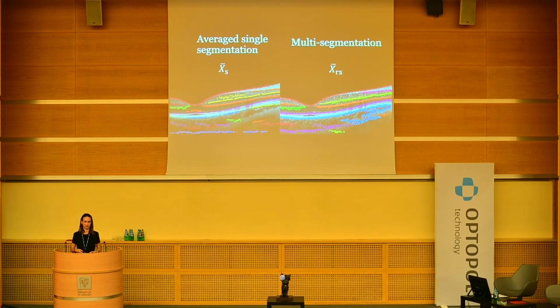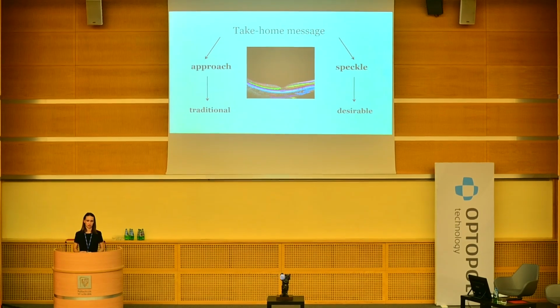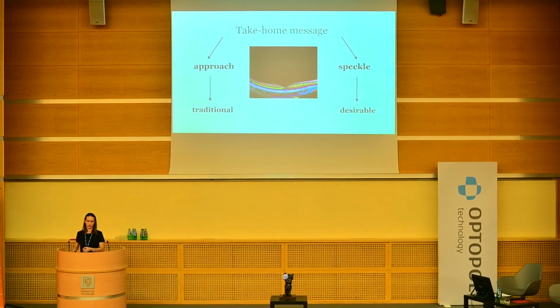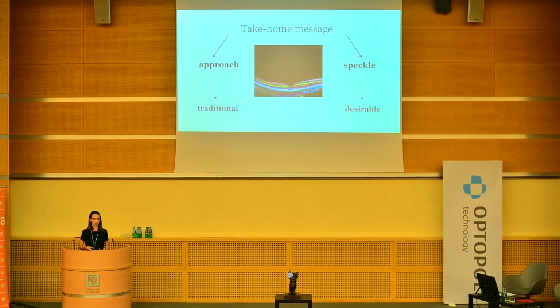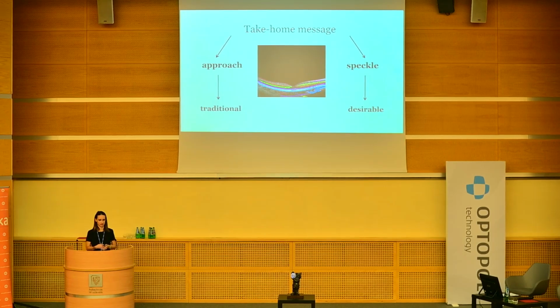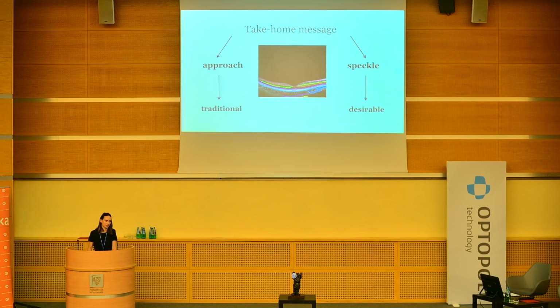And finally, the take-home message is that the approach of performing retinal layer segmentation based on utilizing the speckle information and traditional methods can be introduced and should be taken into account while developing the technology of OCT retinal layer segmentation.